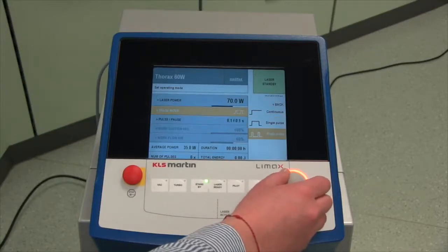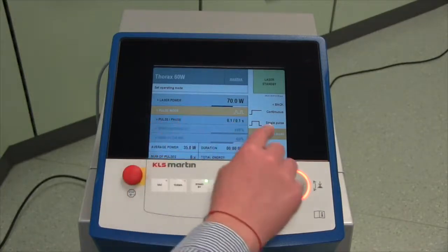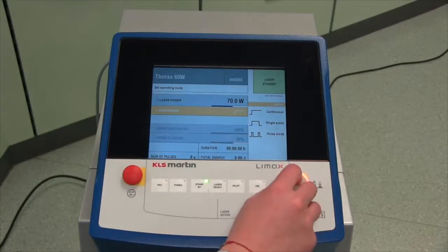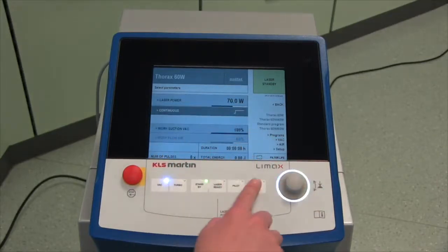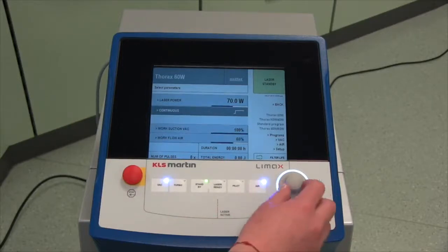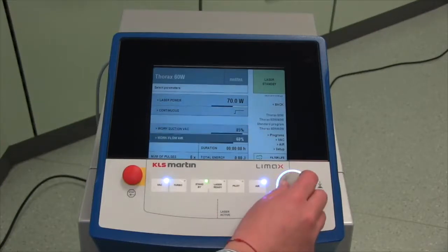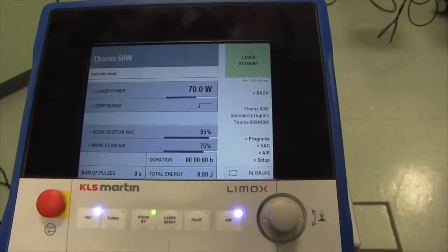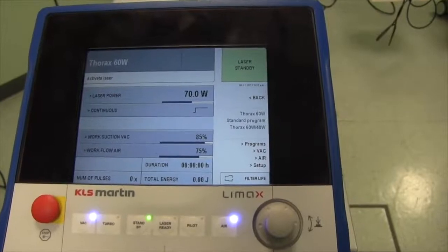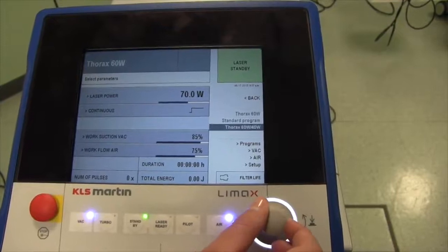Depending on the pulse type, you can set additional parameters like pulse time and pulse pause. Switch on the vac and air and set up the work suction and airflow on the display. Please select again the submenu Programs when you intend to save this program with all adjusted parameter settings.